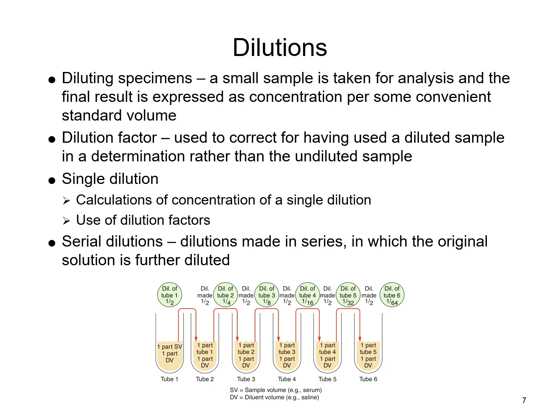When you're diluting a specimen, you're taking a small sample and mixing it with a diluent to make a smaller concentration of the original patient sample analyte present in that sample. Sometimes you may have to do this to figure out at what ratio a patient's sample demonstrates a particular concentration.